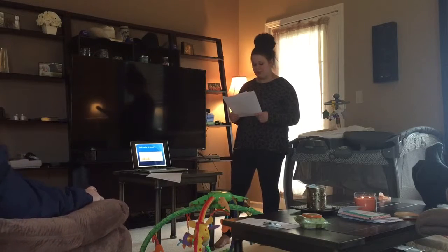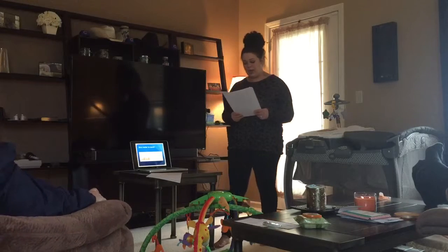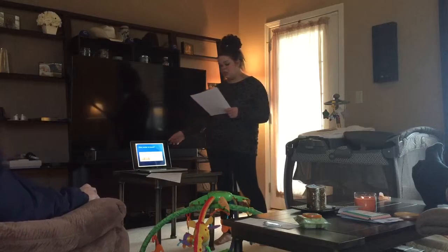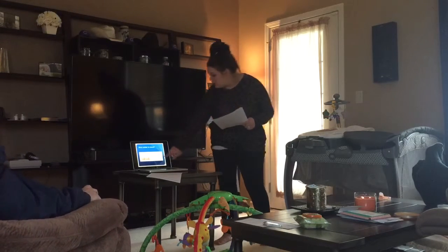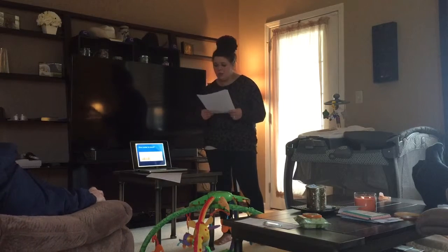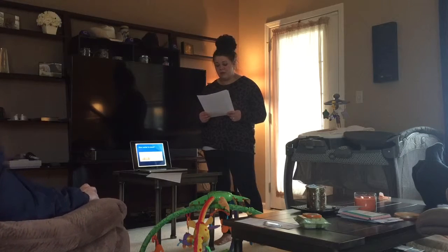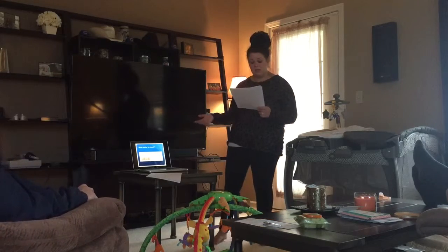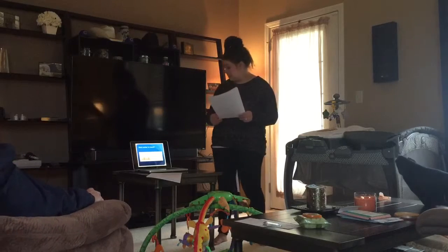What number do you record? When recording the probing depth, you want to record the highest number. For example, in this picture, the clinician is performing the walking stroke on the facial surface of a molar. I know it's really small for you guys, but it's A, B, and C. A and B are 2 millimeters deep. However, C is 5 millimeters deep. You would record 5. Like I said, this could be an indicator of vertical bone loss or dehiscence.